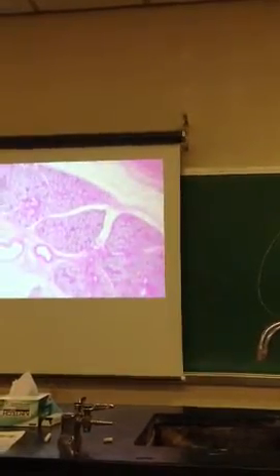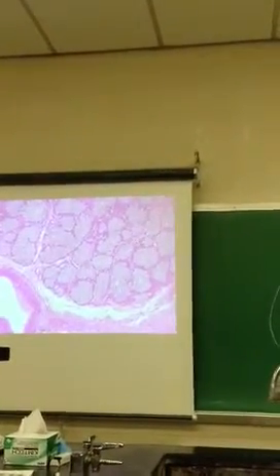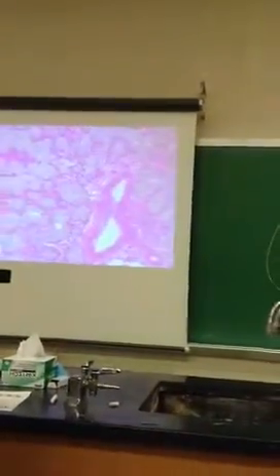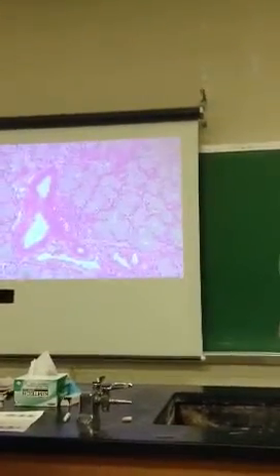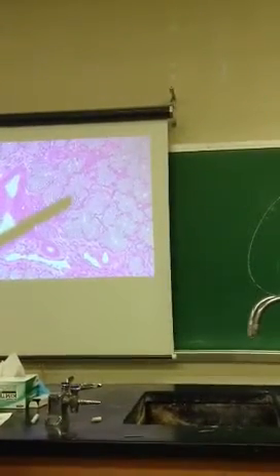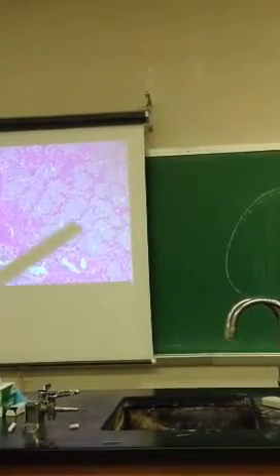Sublingual. A sublingual. That thing, salivary duct. This thing. What else is left? Serous demilunes. Right here and right there.